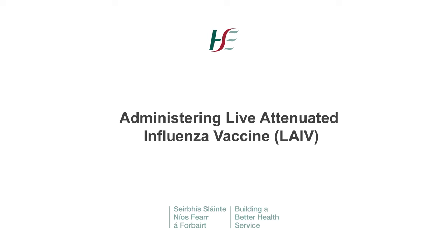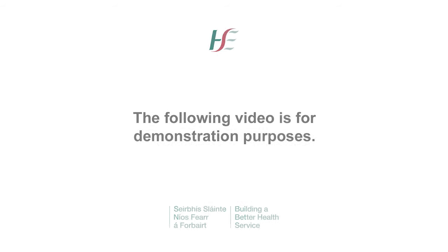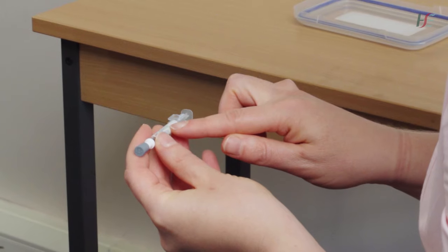Administering live attenuated influenza vaccine. When administering the vaccine, make sure that the child is sitting directly across from you. Check the expiry date on the applicator.